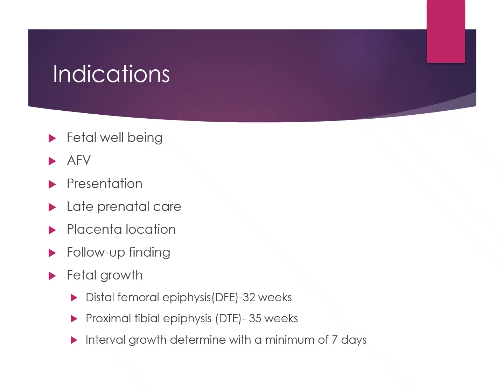Placental location, if they're close to delivery, they prior had placenta previa and they want us to check it out, or they're just checking the overall health grading of the placenta, that would be one that we would do.